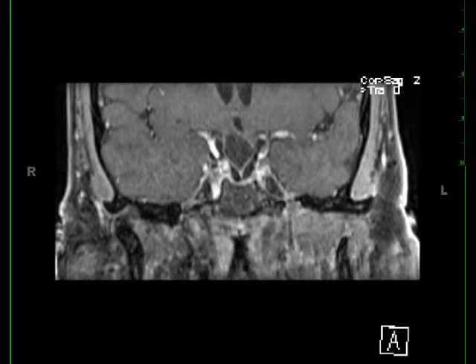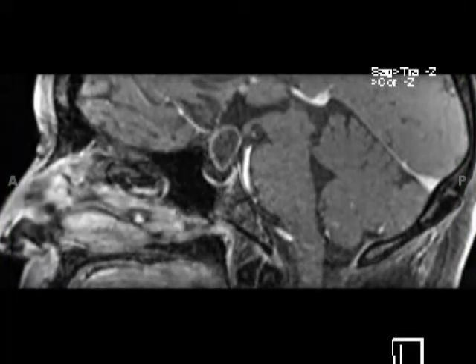The post-contrast T1-weighted images demonstrate a thin enhancing margin of the infundibular lesion. The general differential includes adamantinomatous craniopharyngioma, Rathke's cleft cyst, and infundibular cyst. On further evaluation with CT, there were a few faint calcifications within the lesion wall. On resection, this was found to be a cystic craniopharyngioma.